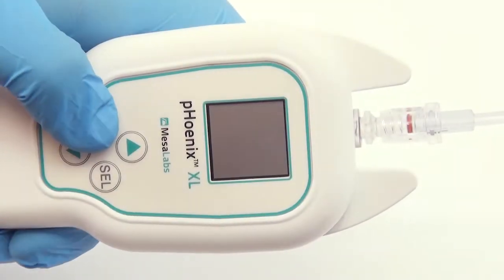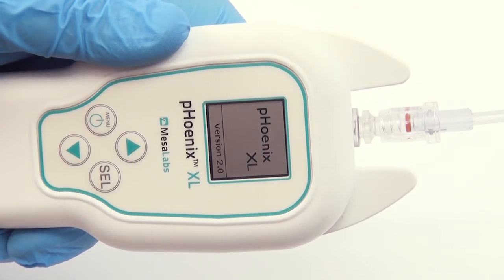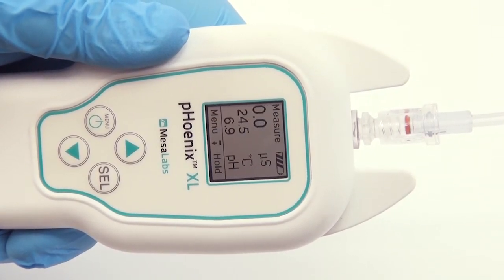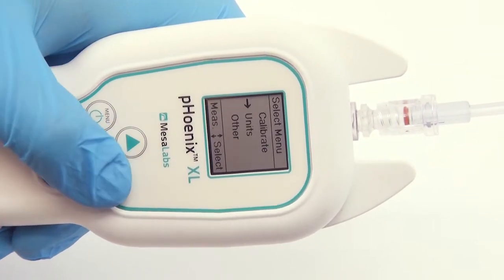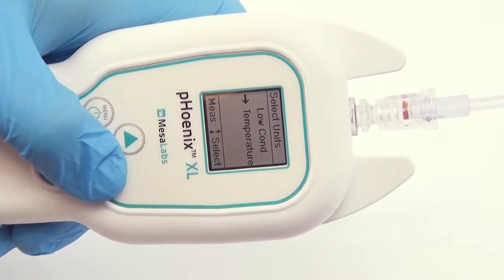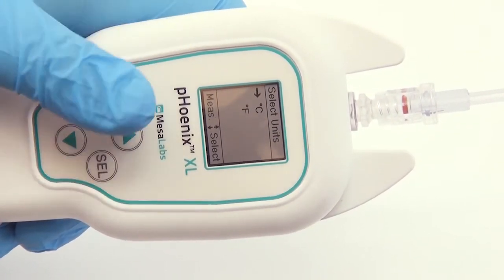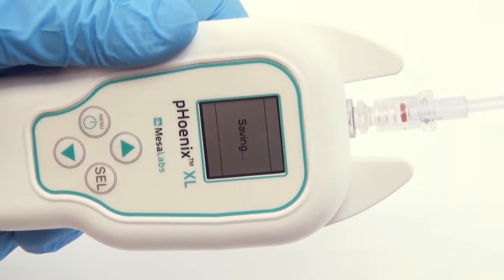Push-button calibration is now fast and easy. The Phoenix XL's intuitive on-screen menus and calibration procedures have been greatly improved to increase accuracy and to simplify the process. Expanded measurement ranges and enhanced resolution for temperature, pH, and conductivity provide the user with higher accuracy in a more versatile meter.